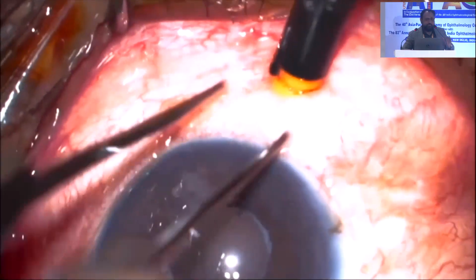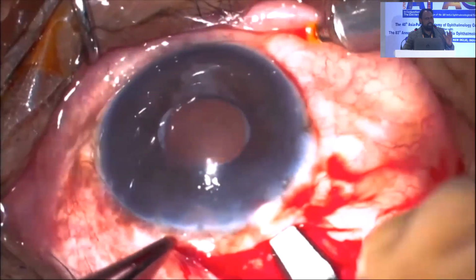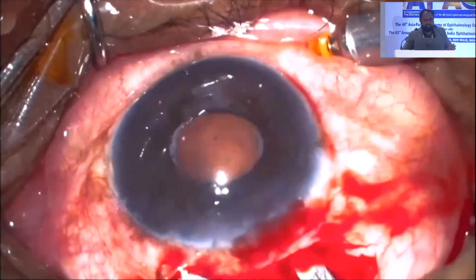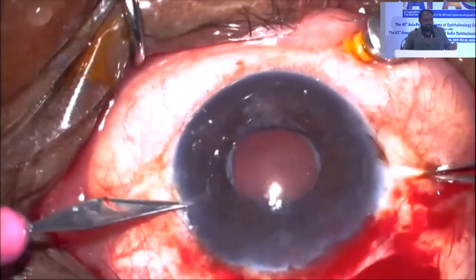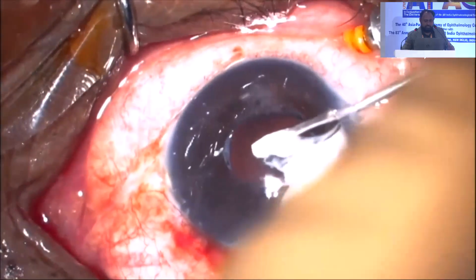As already described, for any of these secondary IOLs, the most important thing is the vitrectomy, anterior vitrectomy. Make sure you clear the vitreous before implanting these lenses. Since it's a rigid lens, we make a sclerocorneal tunnel. As you can see here, that is where you're going to clip, that 180 degree, even with an iris claw. You can do it anywhere you want, but make sure you have the 180 degree entry.